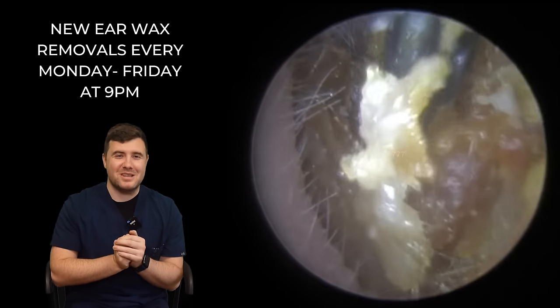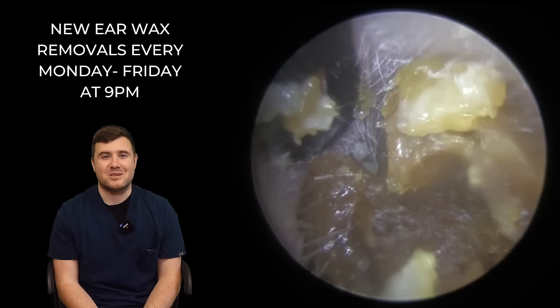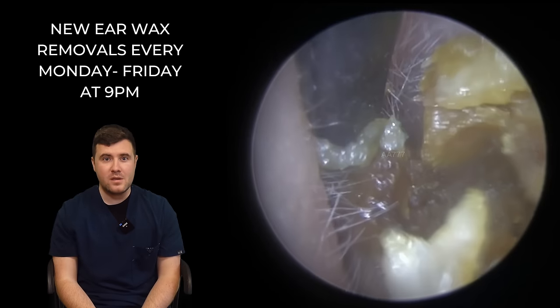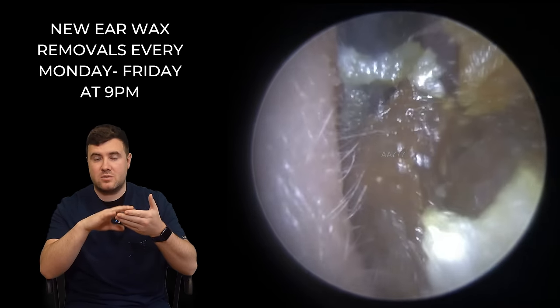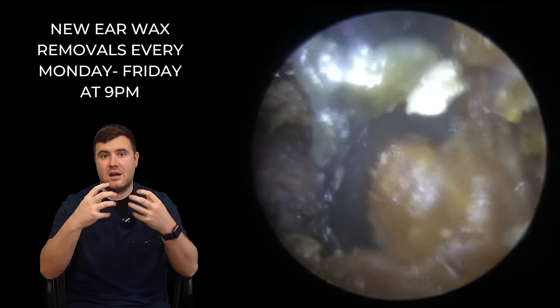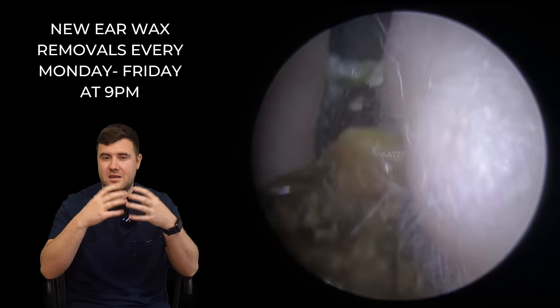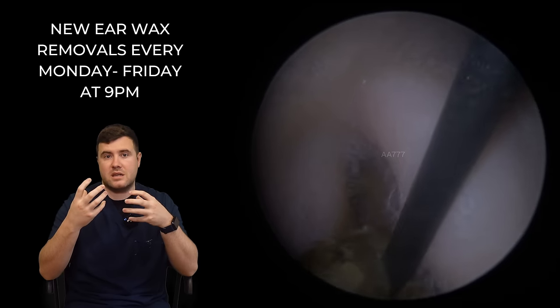It's always harder when you see the wax starting to break apart as it's pulling forwards. So we're just doing the same thing — pulled it forwards, we're going to nip behind and gently roll this out. And you can see the colour difference of this wax, where it's been in there for so long. This is more of the oxidised wax that has just started to darken in colour, so we've got quite a lighter yellowy colour at the entrance, and then a darker sort of chestnut-y colour at the back.